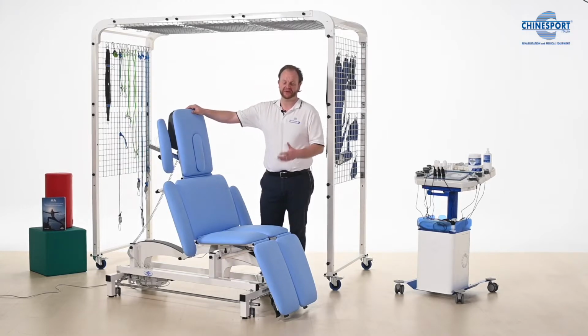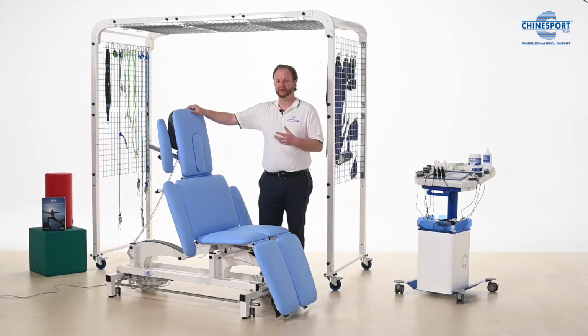Okay, so the Mi.TO synthesis table is more than a therapy table. I would call it a therapeutic table because through the different postures that we can take people in, we can actually almost provide therapy. So the point of today's demonstration is to show you very quickly what we can do with the Mi.TO synthesis table.